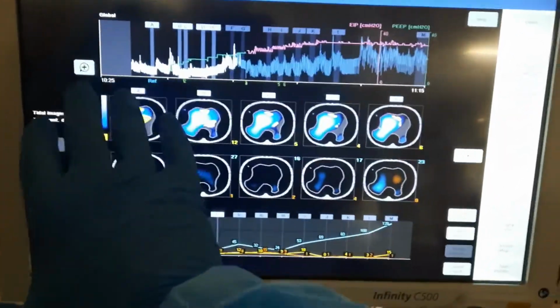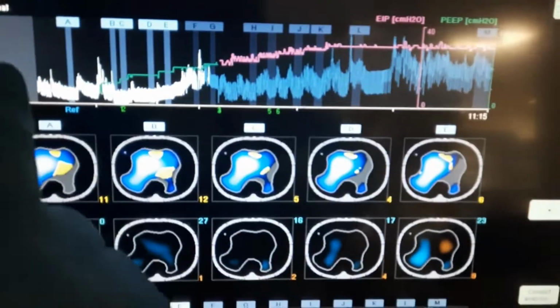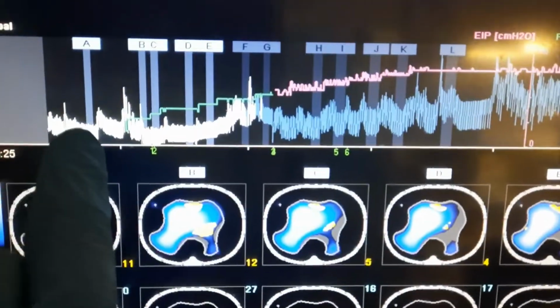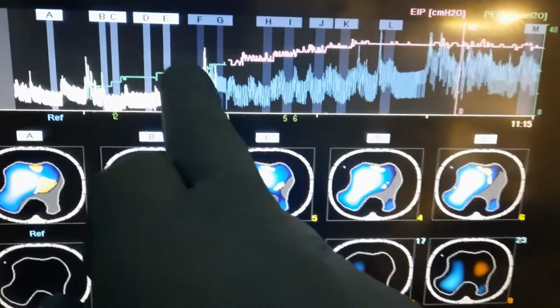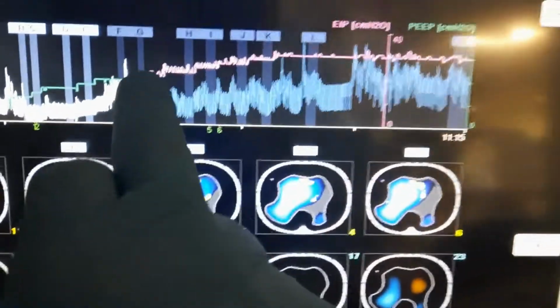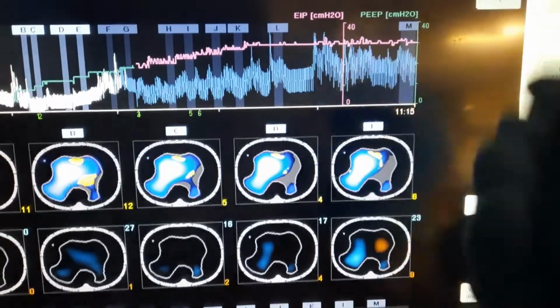So over here is the customized analysis where we're going to evaluate everything that we've done. You can see that all of these are markers at different vent settings. Over here we're starting with OptiFlow, and then we're starting with the reference PEEP of 6 that we were using, and we titrated that all the way up to 20. Then after we transitioned to APRV, you see the loss of the green PEEPs. And then after, you see everything is pink here. This is the titration of your P high from 20 to 30. And now we are staying on 30, and we're trying to recruit.